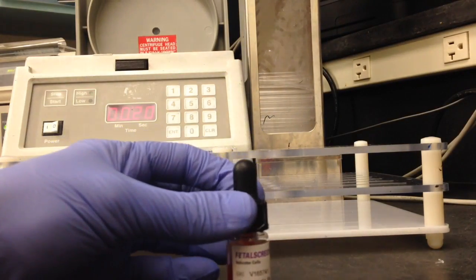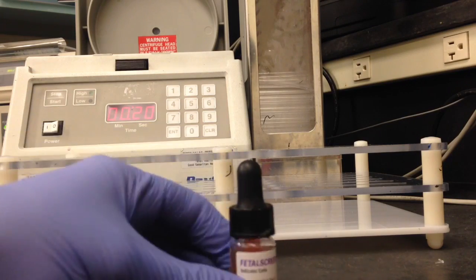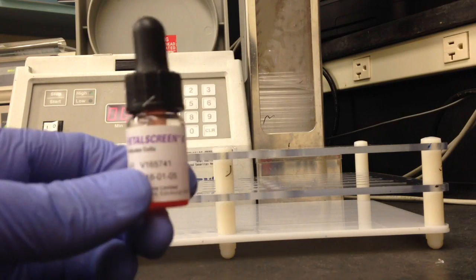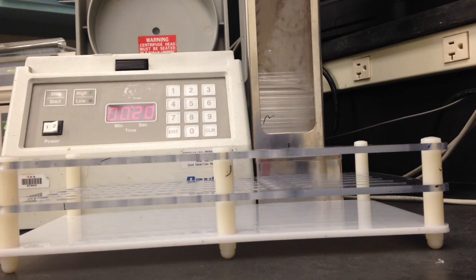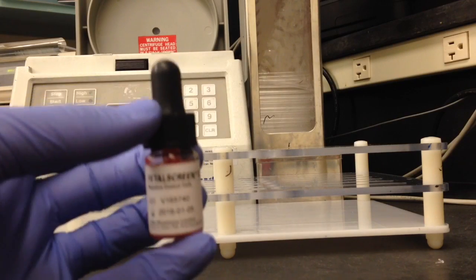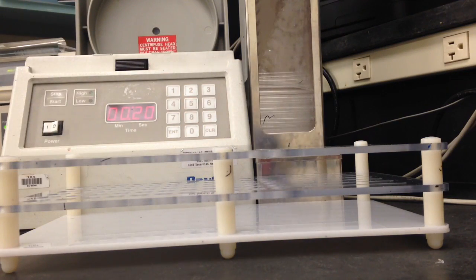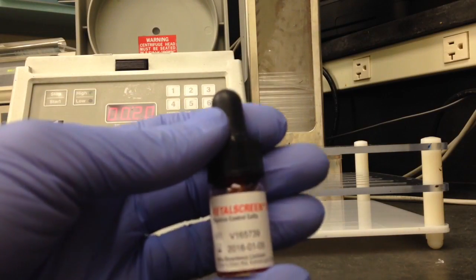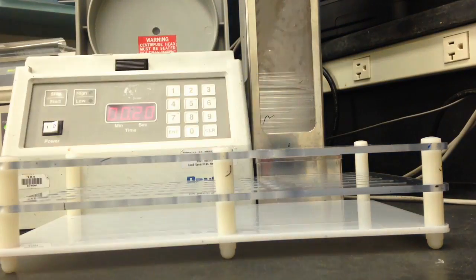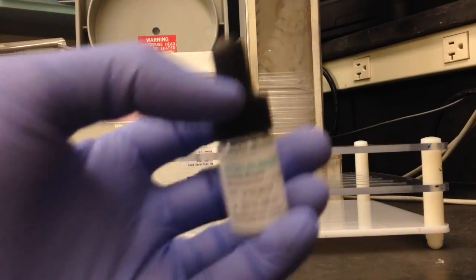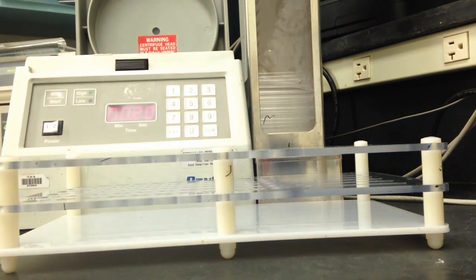You're going to need the kit contents which includes the indicator cells, a positive and a negative control which I'm going to be using as my specimens since I don't actually have a patient, and then you're also going to need the antibody reagent.